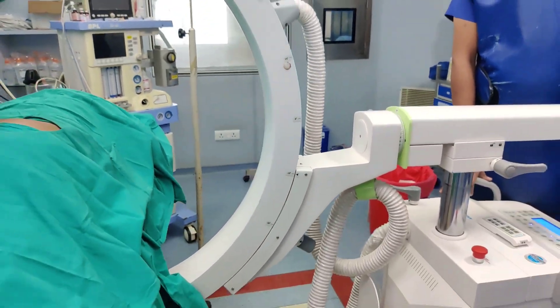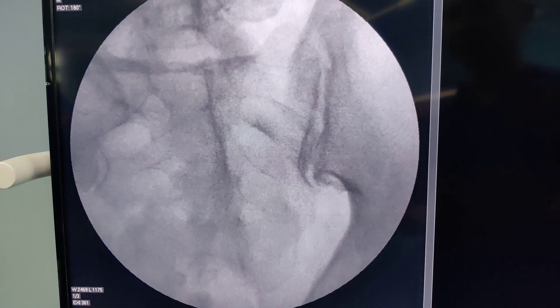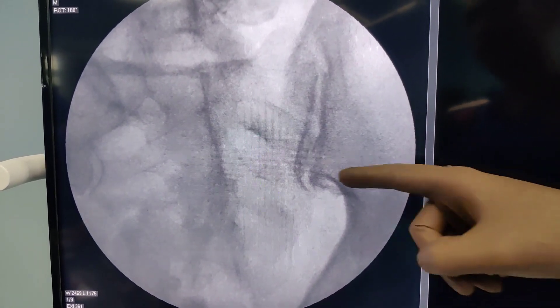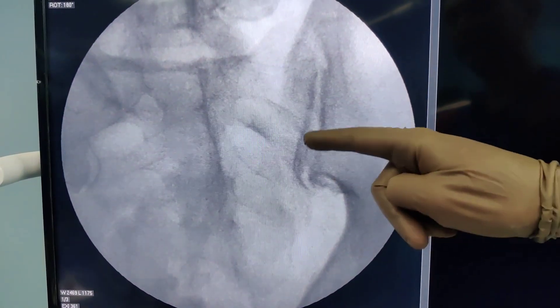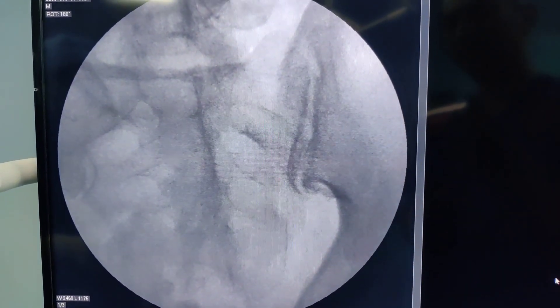With 15 degrees of tilt you will see all across the sacroiliac joint, but the most important part remains the inferior portion. I am going to realign my C-arm back to neutral position, then localize the joint and insert my needle.